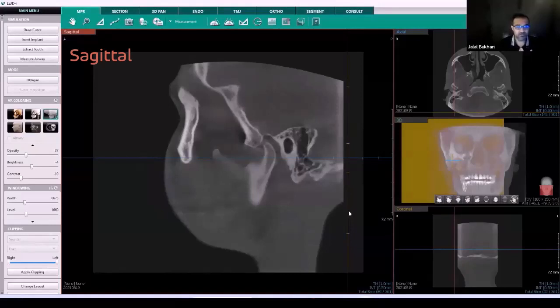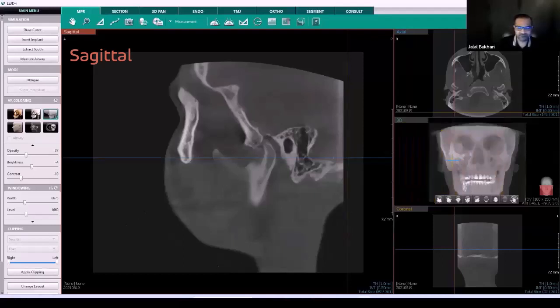But the whole point is that whatever you do, you want to keep a consistent workflow so that you don't miss anything. I think that's the most important thing. You've done your due diligence by going through it once and looking at everything in a certain way, so you keep continuing it. Hopefully it'll be beneficial to the ones who are looking at the scan.